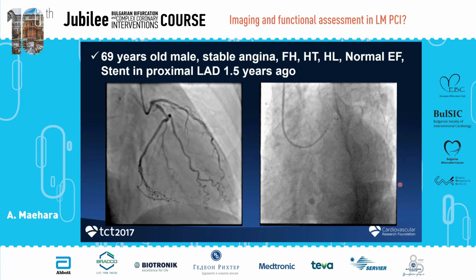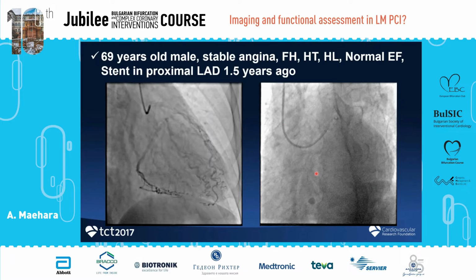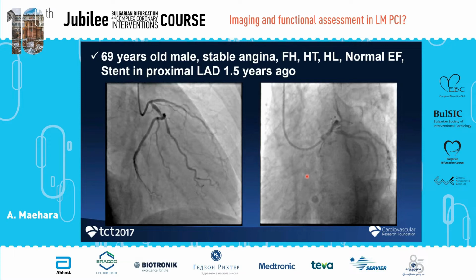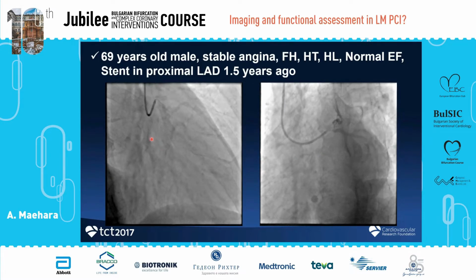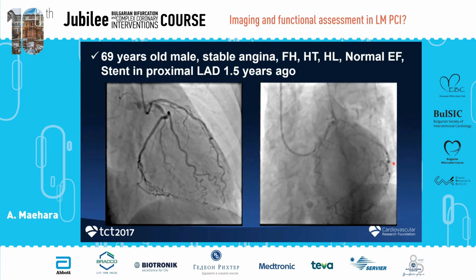So finally, what's happening is this is a case where the patient came back because of an issue at the circumflex ostium. And what do you think? You may want to treat only the circumflex ostium.